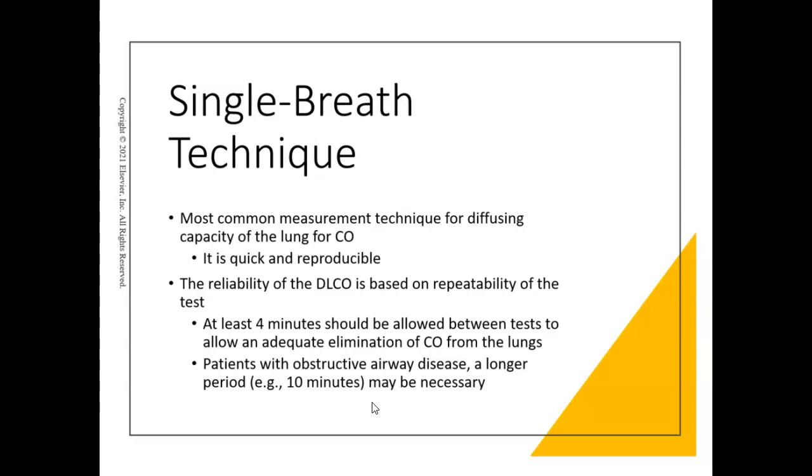But because my patient just breathed in some carbon monoxide, I want to wait at least 4 minutes and sometimes up to 10 minutes to get that CO from the lungs and get more accurate results. So typically I'll do one, I'll wait 10 minutes, and then I'll do the other one. By that time, there's been enough time, and then I can do my bronchodilators. There's not enough carbon monoxide in this test to cause any sort of problem for the patient. It is a very, very low amount.